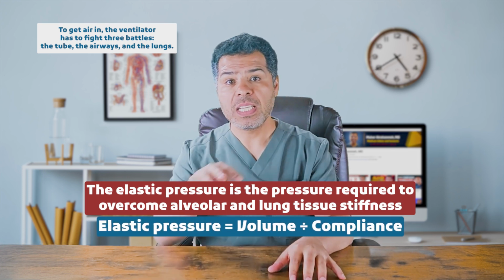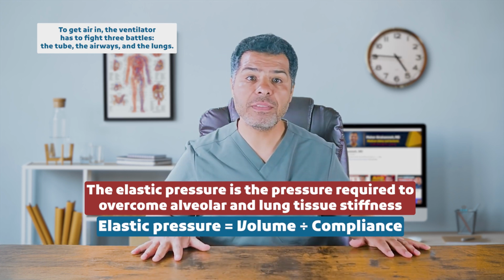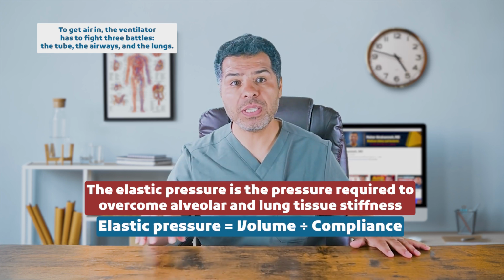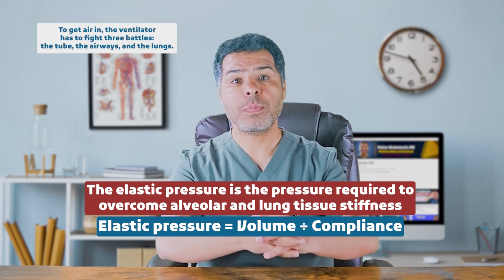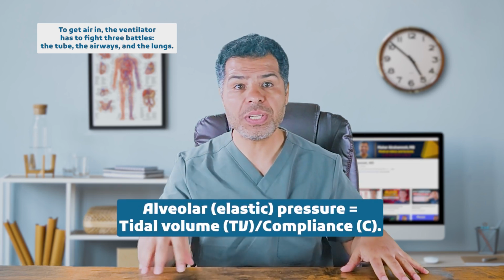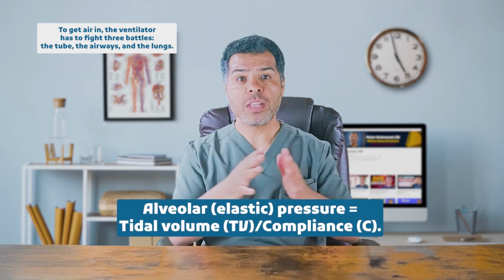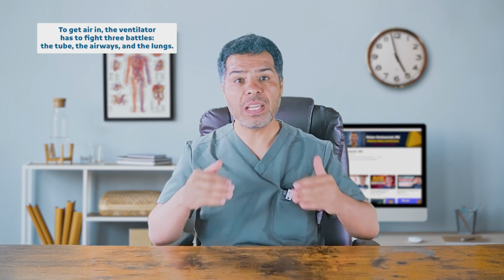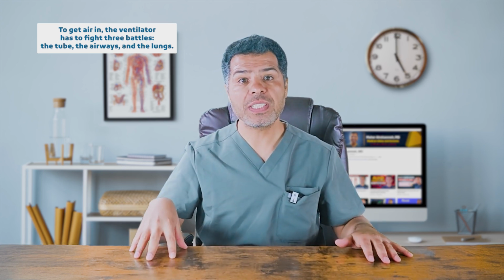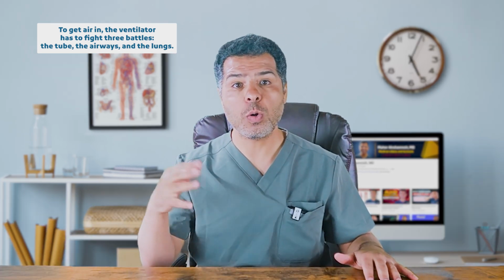by compliance. So elastic pressure equals volume divided by compliance, and in mechanical ventilation, the volume here simply represents the tidal volume and the elastic pressure represents the alveolar pressure. So the equation can be rewritten as alveolar pressure equals tidal volume divided by compliance. Therefore, for a full breath to be delivered, the ventilator must generate enough total pressure to overcome both the resistive and elastic or alveolar pressure.